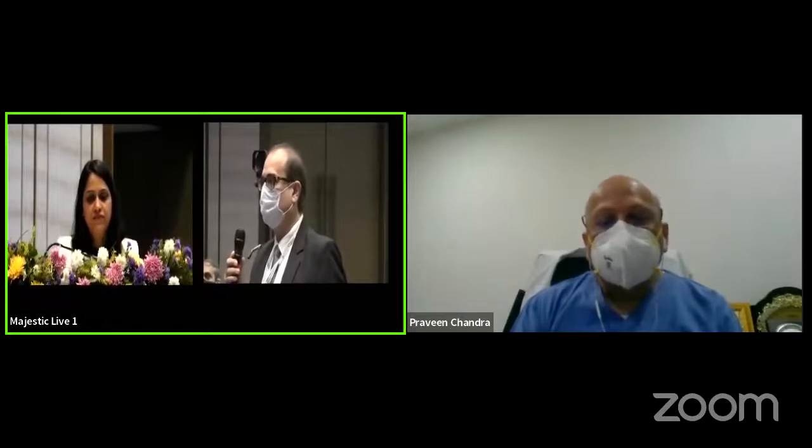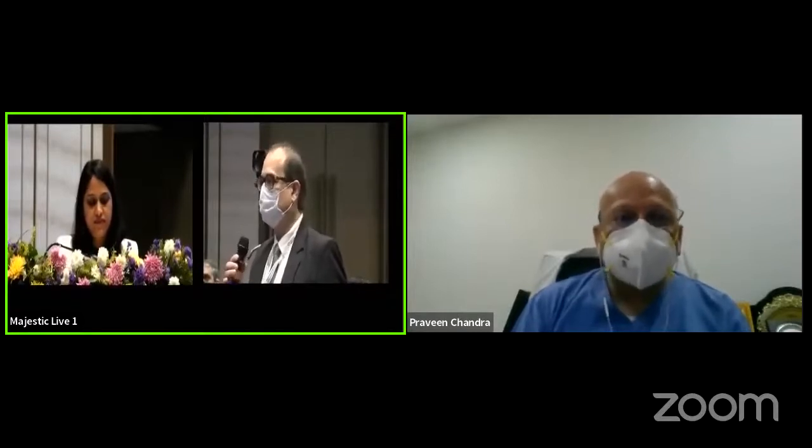And then we took our cardiologist colleagues' help, and we did a direct transaortic approach when the sternum was open, and we did a transcatheter valve and put a self-expandable valve as well as did the LIMA to LAD, and we could discharge the patient on the 4th day. 80-year-old gentleman with renal dysfunction, and I think this is what exactly the alternative approaches are. So we are not stuck with the femoral, and we could choose the alternative approach, and we could discharge the patient on the 4th day without any problem. And so I think the alternative approaches, as you very rightly said, we should be really considering and thinking of, whatever it takes to do that.